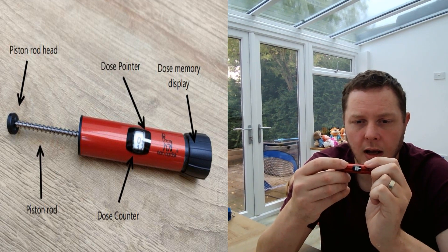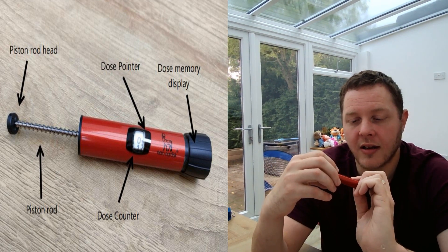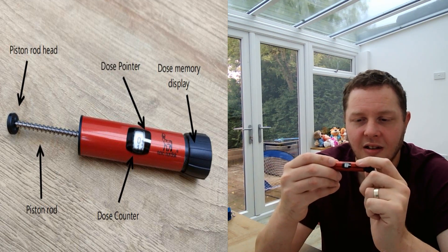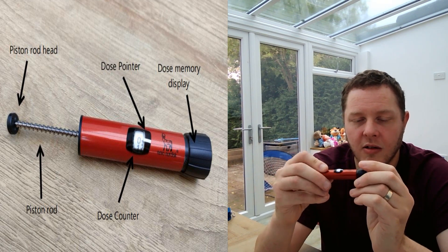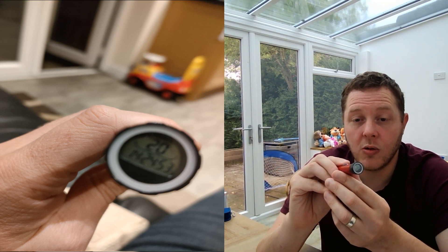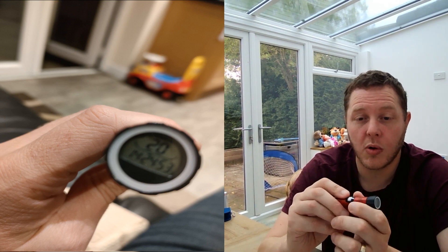Looking further down the pen, you've got the dose pointer — the white line — which will show you where the units are at. Currently it says eight units, and you can dial up to see how many units you want to inject, which you can also see on the dose counter. Let's put it back down to zero. At the bottom you've got the dose memory button — if you click that in, it will tell you how many units you injected last and the time since your last injection, which is so important.